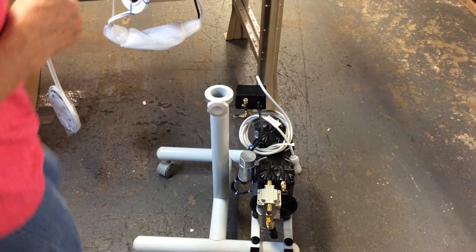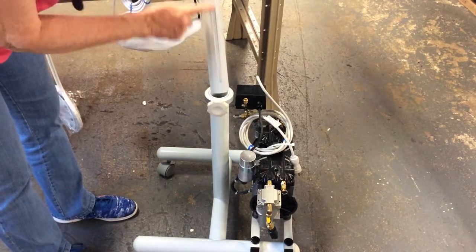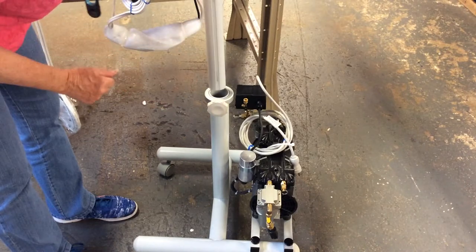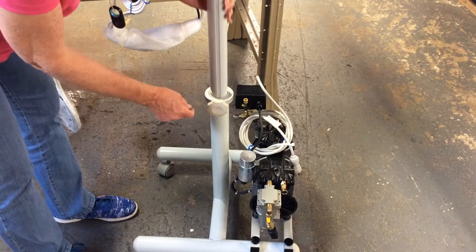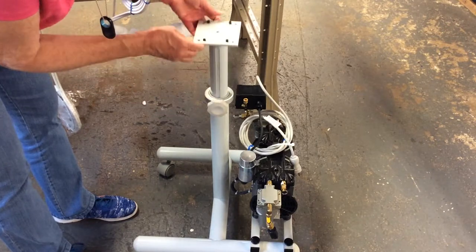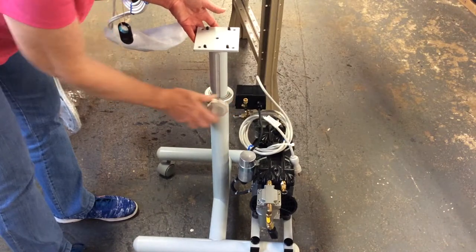We are now going to install the platform to the H-frame. Notice this tube has a groove going through it. Align the screw with the screw on the knob, adjust it to the height that you want, and tighten it down.